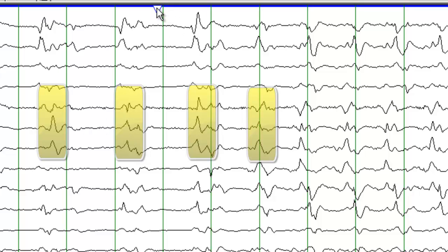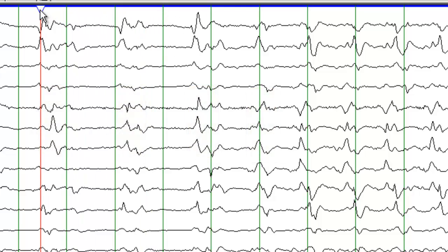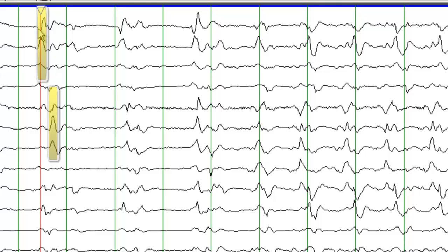An important thing to note here is, let's put the cursor on the sharp waves on the left side. These are not synchronized with the sharp waves on the right side. So these are independent sharp waves.